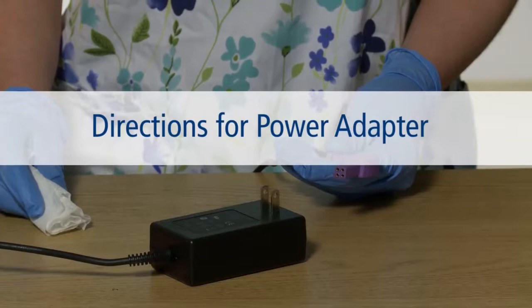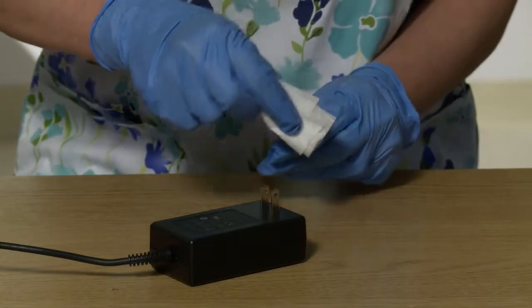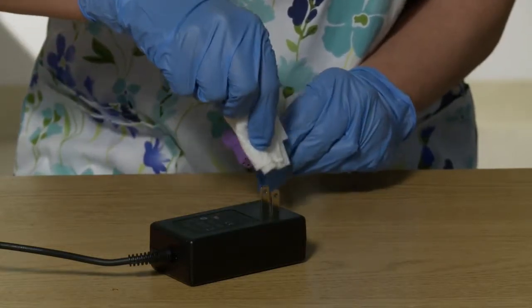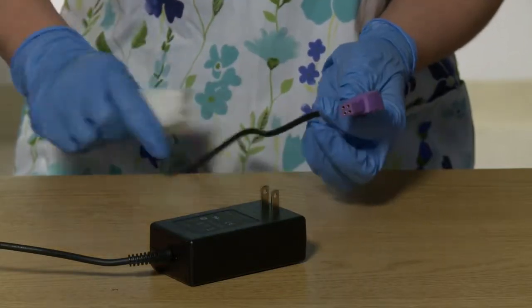Directions for cleaning the power adapter. Unless soiling is observed, the power adapter should not be cleaned. If cleaning is necessary, unplug from the outlet and wipe the exterior surfaces of the wall plug with a cloth dampened with isopropyl alcohol.